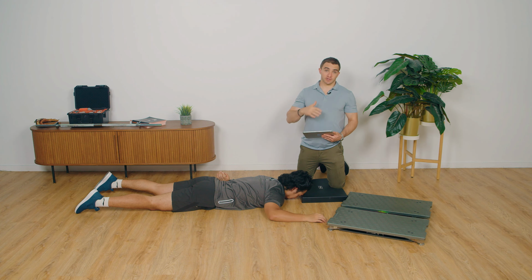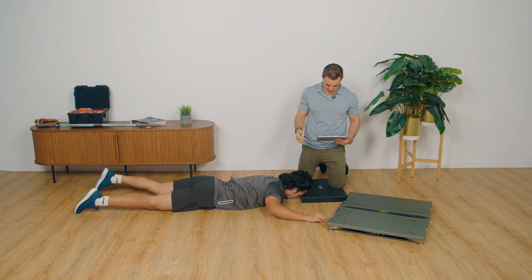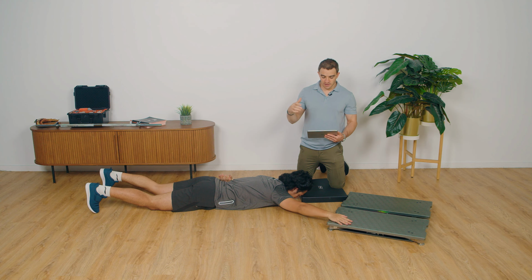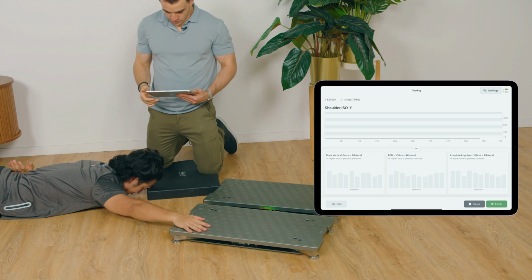But what Ben Ashworth encourages people to do is not just look at peak force and not just look at RFD, but look at both of them and then compare the two. So what we'll do is we'll do 2 different tests and I'll show you how we cue differently. So Cal, go ahead and get into position. First, we're going to look at peak force. So my cue to Cal for this is to generate force at a moderate pace, but to just build up to his peak force overall, expressing as much force as possible, but not with the intent to do it as quickly as possible. So when you're ready, Cal, 3, 2, 1, go.